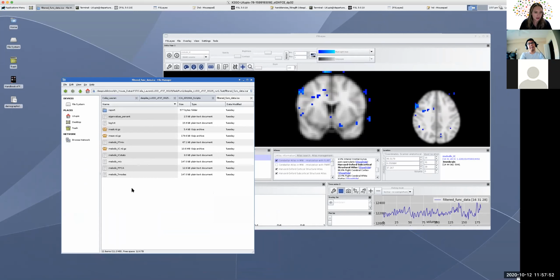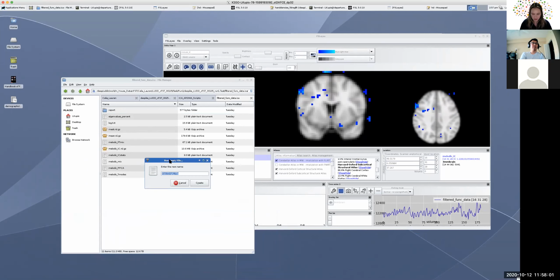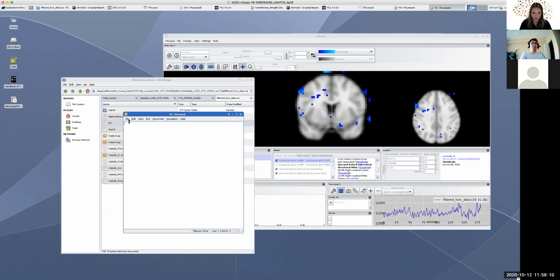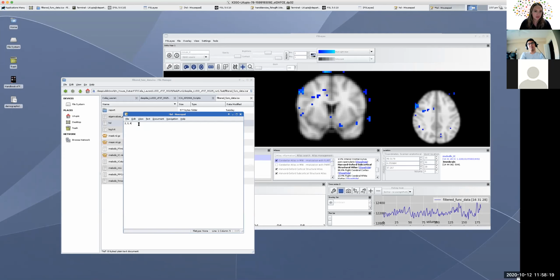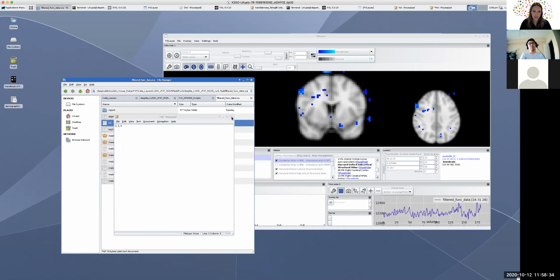So I would go ahead and create a file, an empty file, and then you just name it whatever, HD, but instead of copying over what was already classified, you have to put the noise components yourself. So I would put whichever ones I classify as noise just within this text file, because we're still going to have to run the FSL regfilt command afterwards for the subject. So that's the only difference if you use melodic through FSL versus doing the Aroma script that I showed you guys.